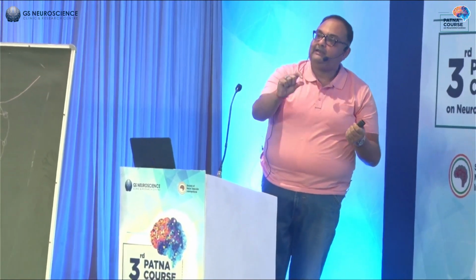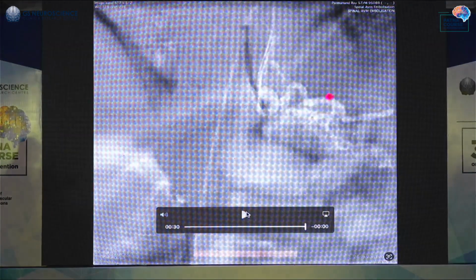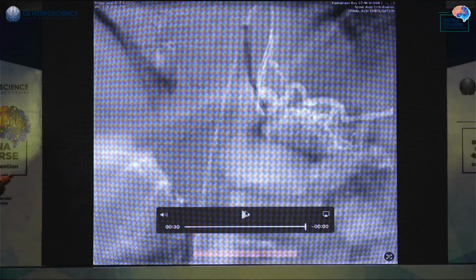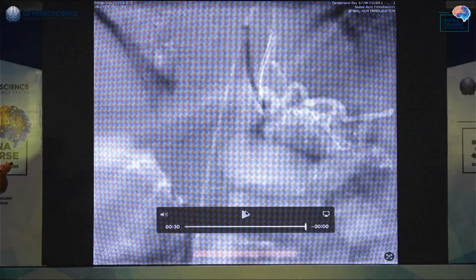What you are pushing at the groin is not getting transmitted to the tip. So you have to load the entire system with inertia on the microcatheter, take your wire more distal, and then when you keep on pushing, pulling and torquing the wire, your catheter will generally go in front.